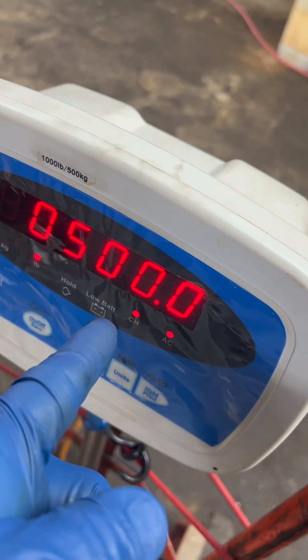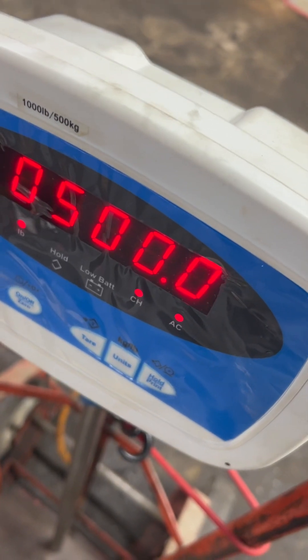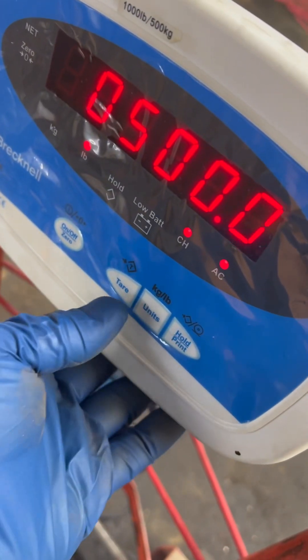Cal point one, the 500. At this point, you apply your weight. Once you apply your weight — you can change this number if you want to. I applied the 500, so it's tare.